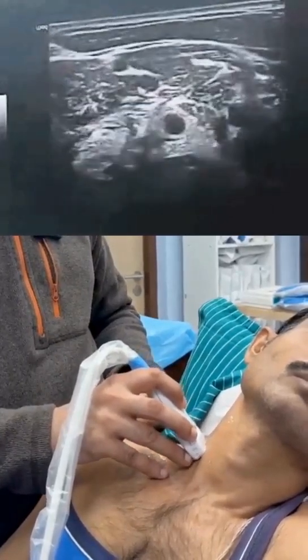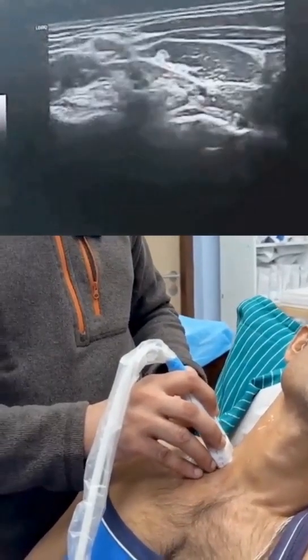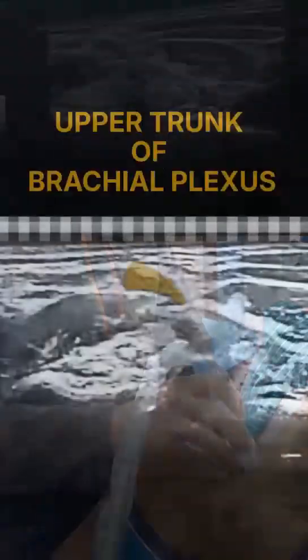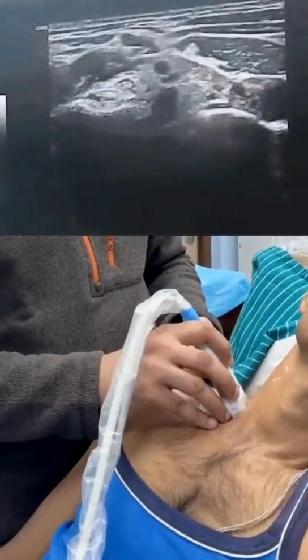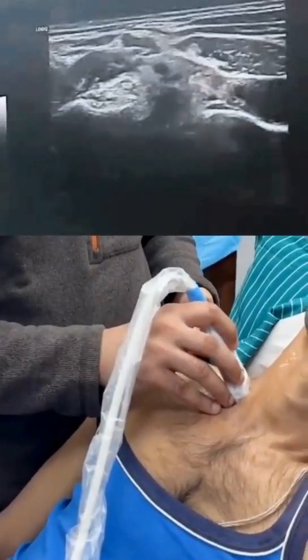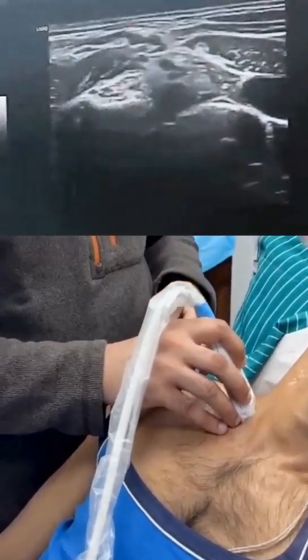Follow C5 and C6 downwards until they join with each other. Now that they've joined, this is the upper trunk. I would expect the suprascapular nerve to arise from the lateral border of this trunk.